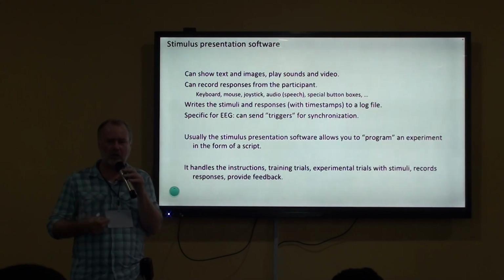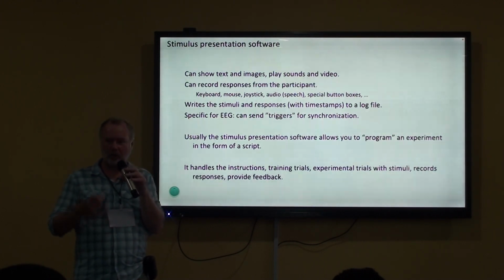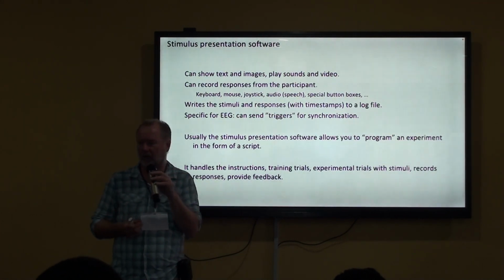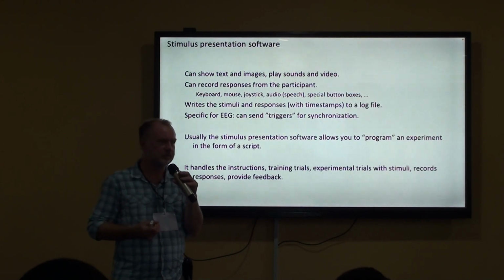But specific for EEG, the stimulus presentation software can also send a trigger. A trigger is a small signal that is sent over a cable towards the EEG device. We're going to show you in the hands-on session, or in the demo after this lecture, what that looks like.